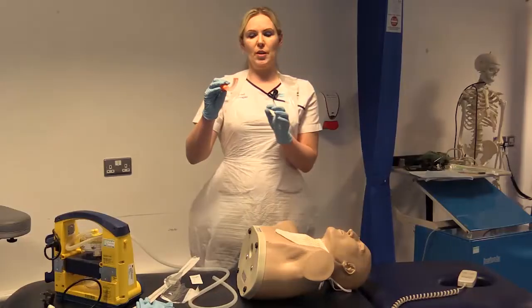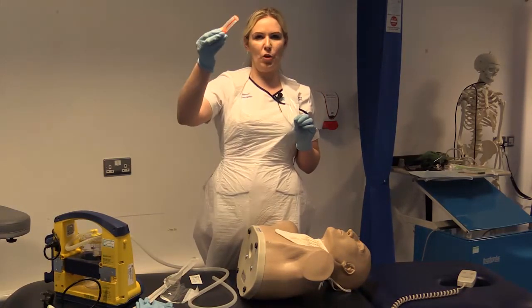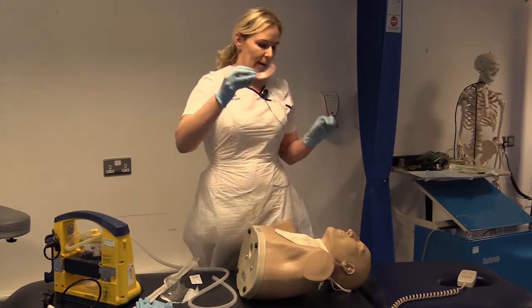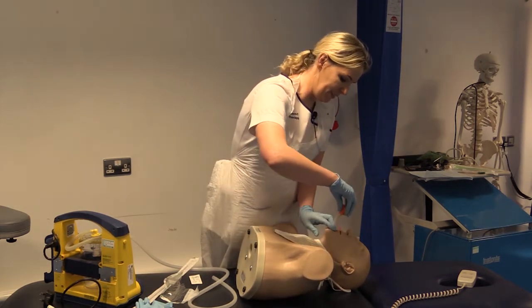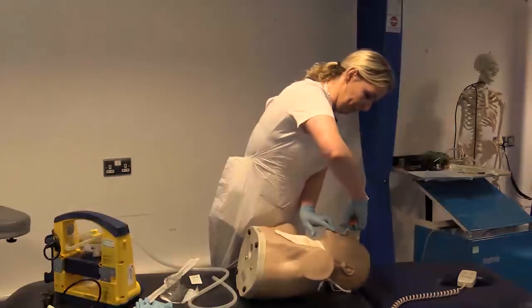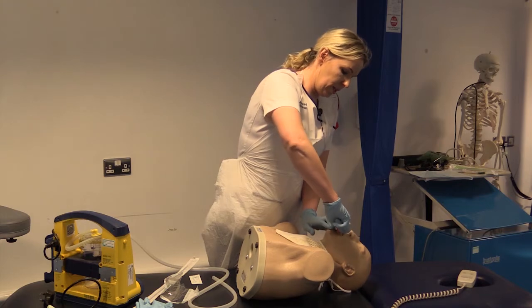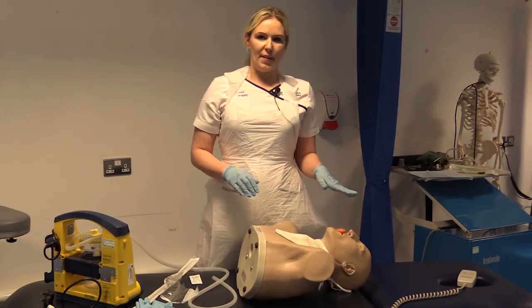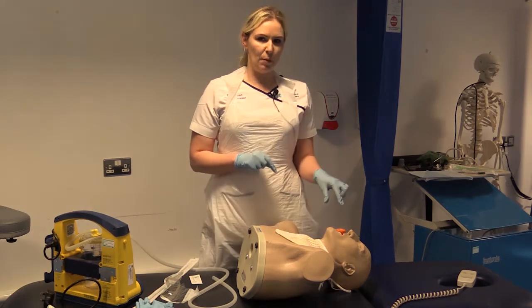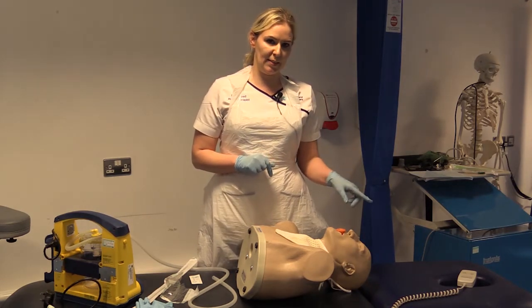So to insert, we're going to insert with the tip pointing upwards for the first 2/3 of the way in, and then we're going to turn after that point. On this model it's a bit harder, but in a real situation it will be much easier. When we're about 2/3 of the way in, we're going to turn. At this point you reassure your patient that they can still breathe through the airway. You may need a second person to hold that in place.